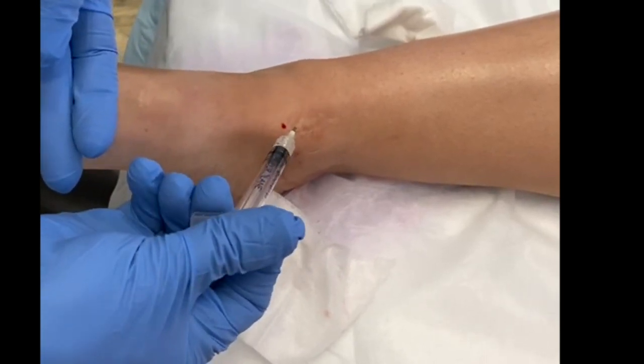I inject the whole ampule and withdraw. That's the intra-articular injection of medication into the ankle joint, using the medial joint space as the entry point. Thank you.